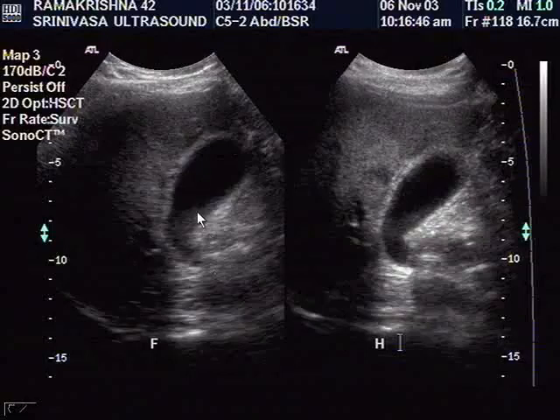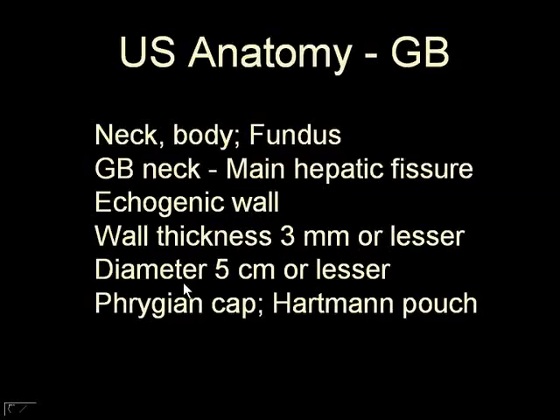Now that's the importance of harmonics. You see the gallbladder there, you see the gallbladder here. In harmonics, your contours appear much clearer. There's a cleaning up of the image which occurs, more contrasty.